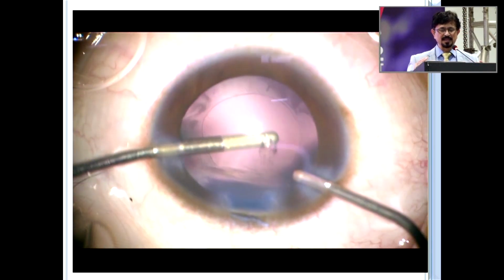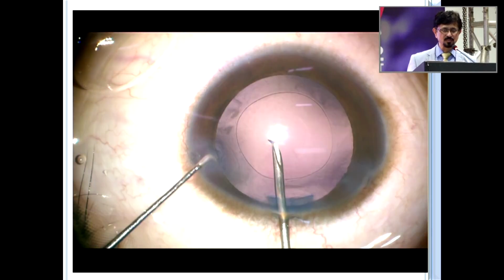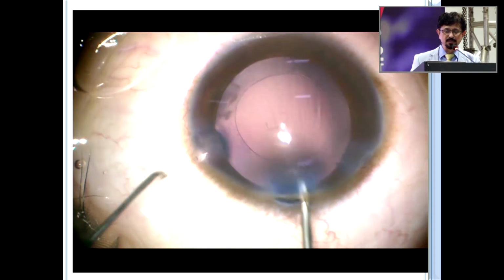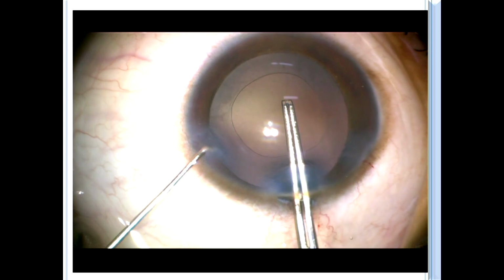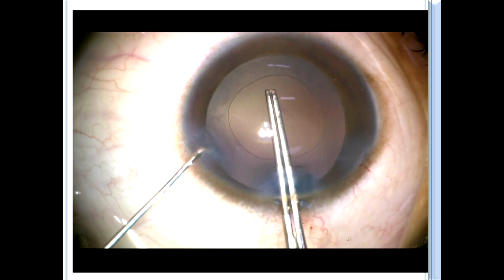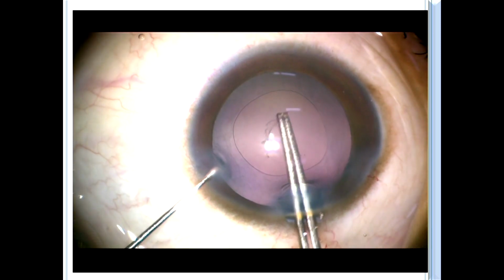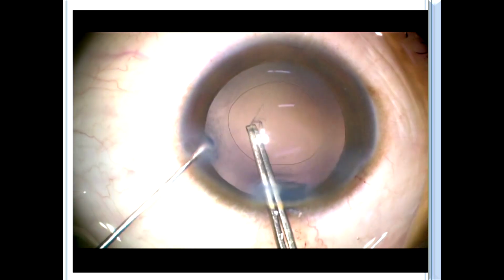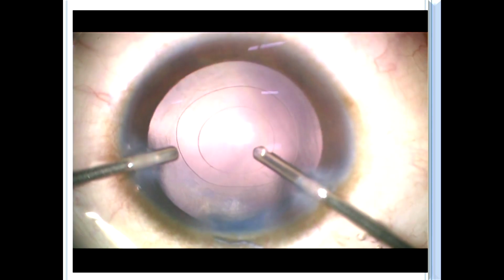So if some fibers are there, then you need to remove them, because these fibers will proliferate and cause Soemmering ring in future. Then posterior capsular rhexis should be done by injecting a little bit of viscoelastic. Don't overfill the chamber with viscoelastic. And then once you have done the posterior capsular rhexis, you try to center it, because the opening and the clarity of that area will coincide with the center of the IOL. So this is how we should do it.